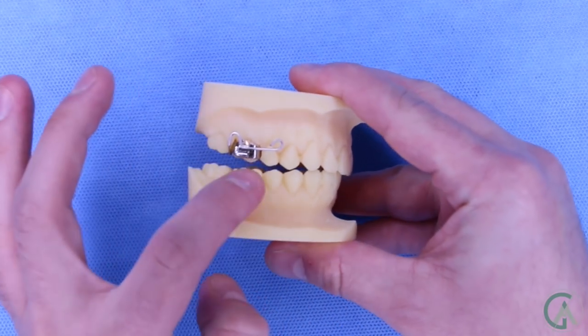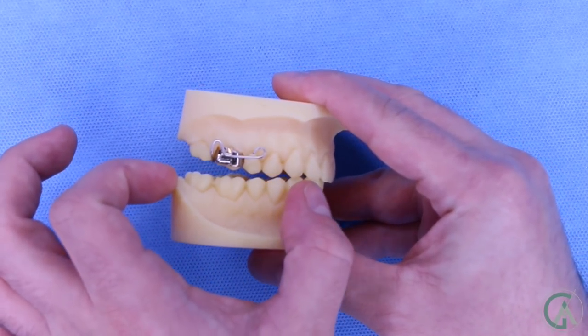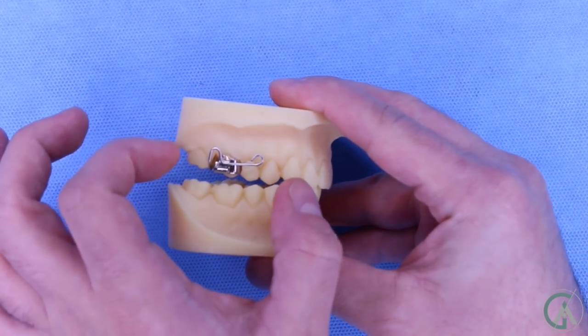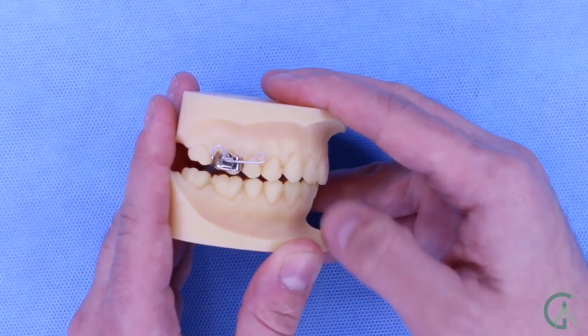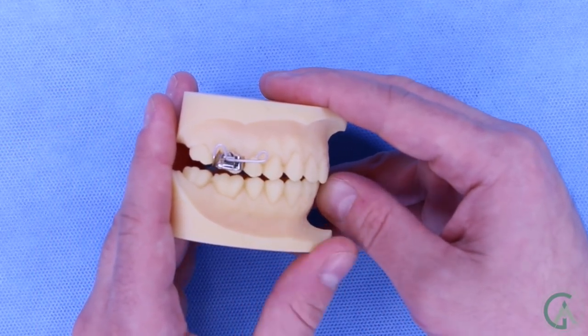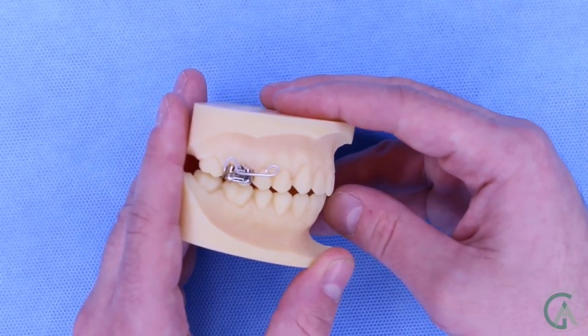The other way that anterior bite plates work is that they create a little bit of a gap between your back teeth, which allows your back teeth to erupt a little bit more and make it so that your deep bite becomes less deep. When you're in a bite plate, your back teeth have a tendency to not touch, so this allows your back teeth to extrude on the top and on the bottom until they touch. And when they do, your deep bite will be a little bit less deep because your back teeth will be touching earlier.